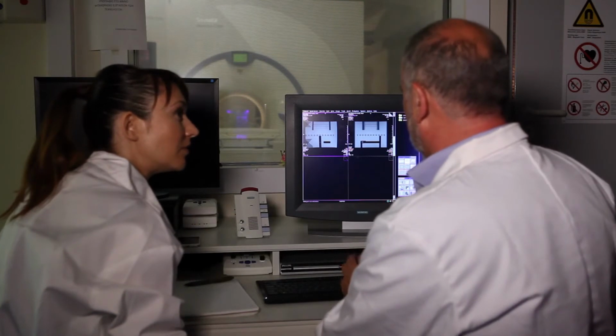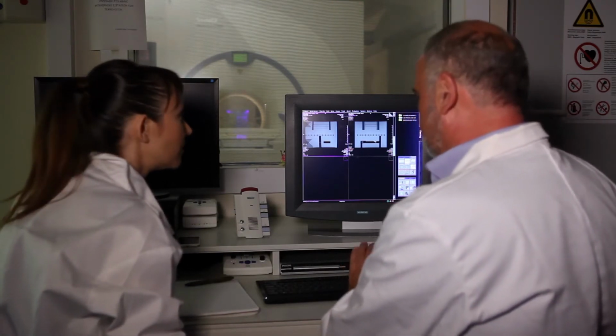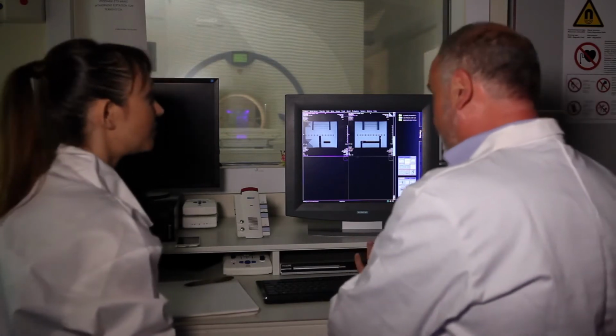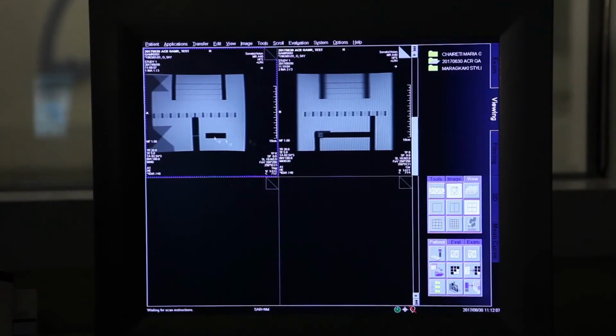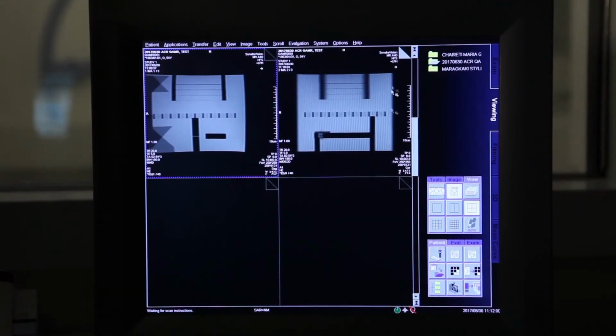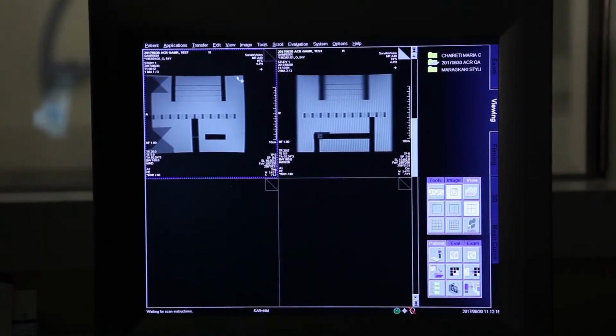No, we cannot do it because we change the geometries, and that's exactly the drawback of the system. So you either have a non-corrected image, which you can use as a localizer to localize the rest of the scans, or you can have a linear image, I mean a corrected image, but this cannot be used as a localizer, because we change the geometry, and if you change the geometry, you cannot have specific localization.